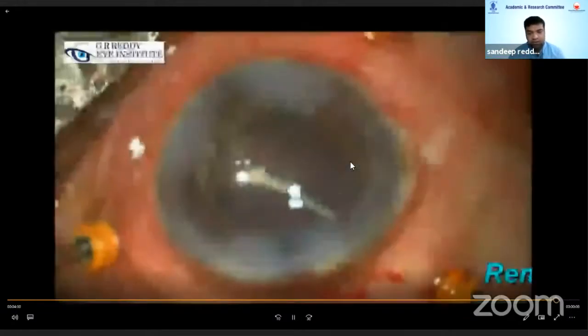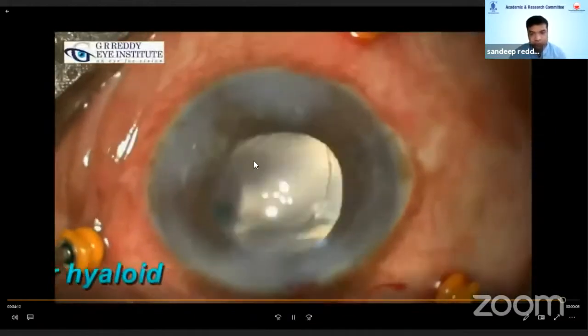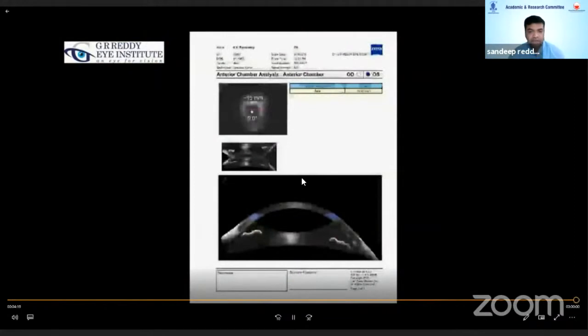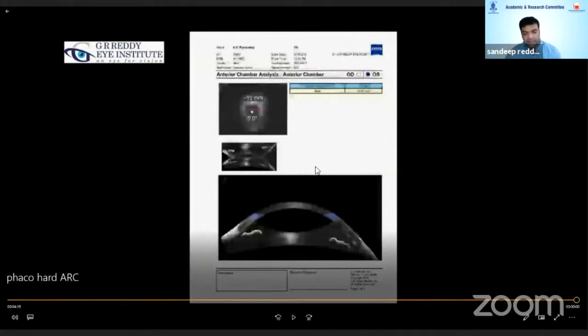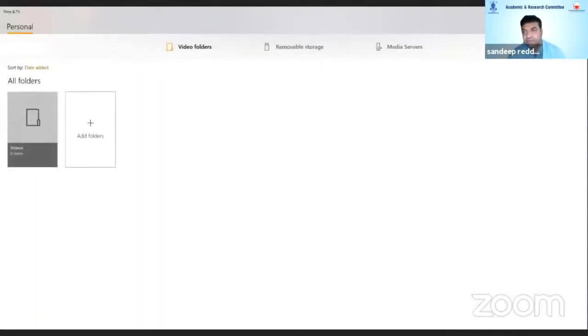I placed the lens and at the end of the surgery I also removed the anterior hyaloid as well as the posterior capsule so that the entire eyeball becomes a single chamber. The patient did very well and did not require any glaucoma drainage surgery after this procedure. His IOP maintained at 15–16 even though he had raised IOP for more than two weeks. So the tip I follow whenever I have a hard eye is to do a dry vitrectomy. Thank you.